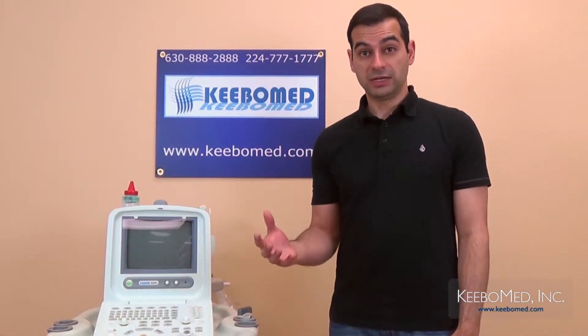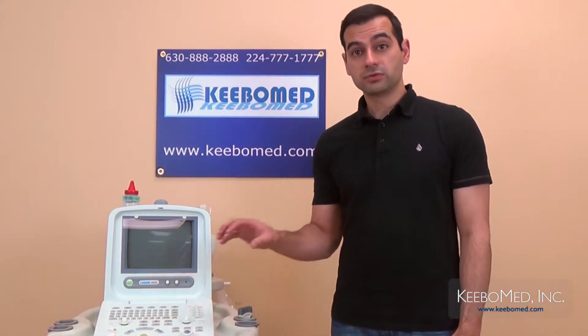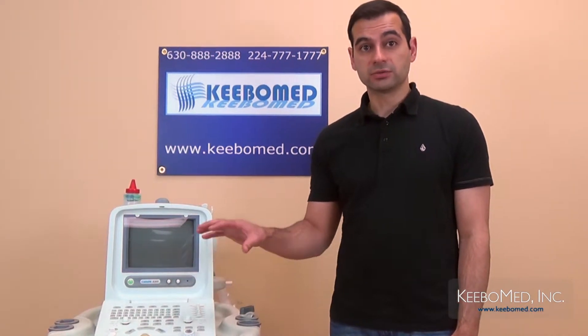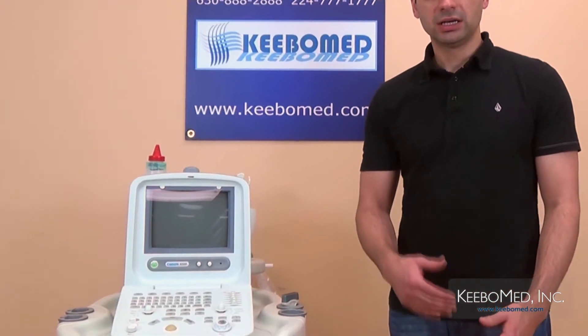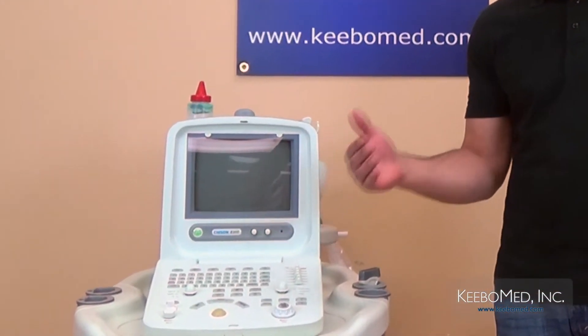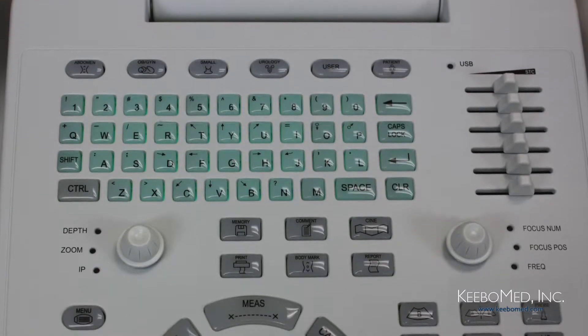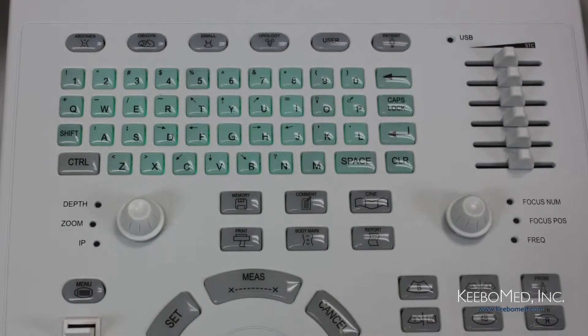Let's consider the advantages of the keyboard. Overall, the 8300 has an ergonomically designed keyboard. Its layout is arranged in an organized way, and this allows remembering where specific keys are very easily. It has multi-function knobs, STC slides, and one-touch keys.